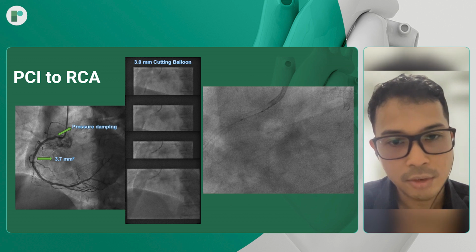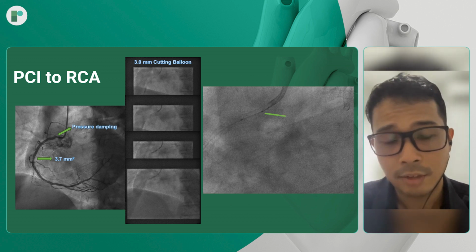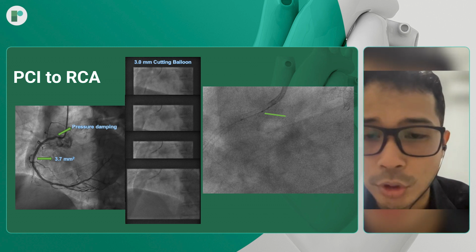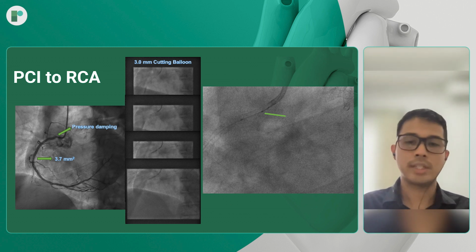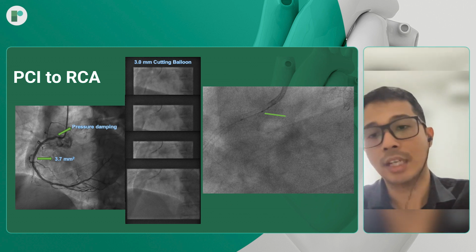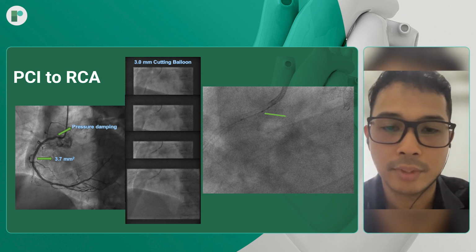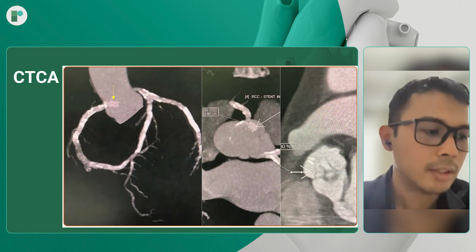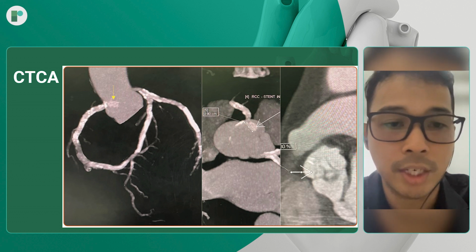And at this stage, when we performed stent enhancement or the stent boost, we appreciated that there was stent protrusion there on the aorto-ostial of the RCA. So at this time, we discussed with the other interventional cardiologists and the team, and we decided to stop this procedure for now because of the concerns of stent fracture due to embolization.